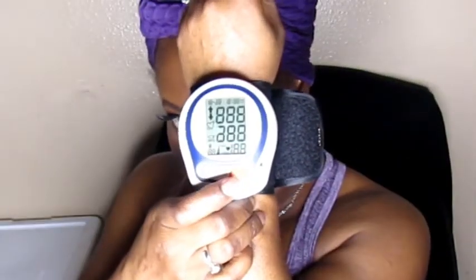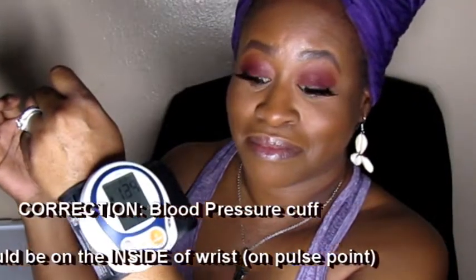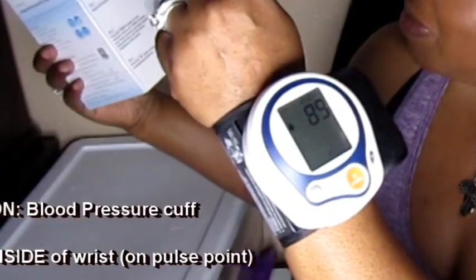Let me try this again. And let's press start. Okay, now it's loosening up. So, blood pressure kind of high, y'all. 154 over 114. Did I take my medicine today? So, there you go.